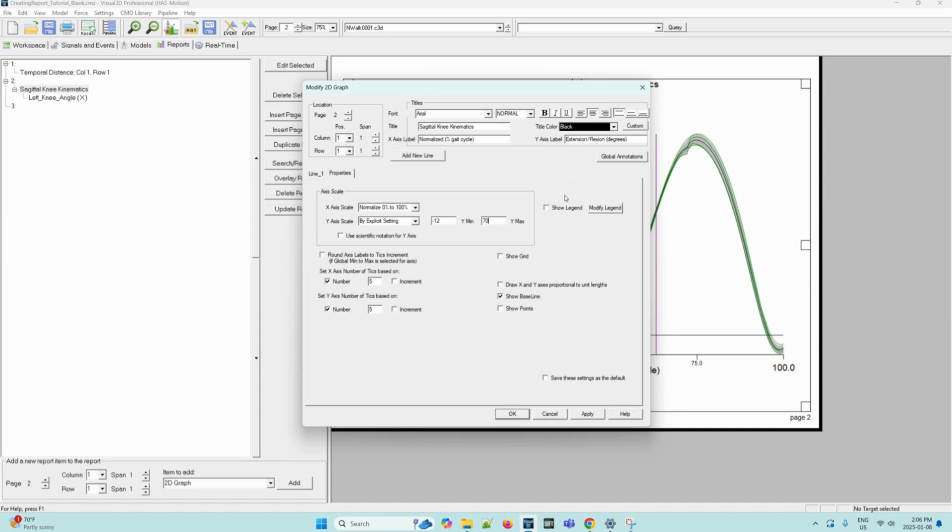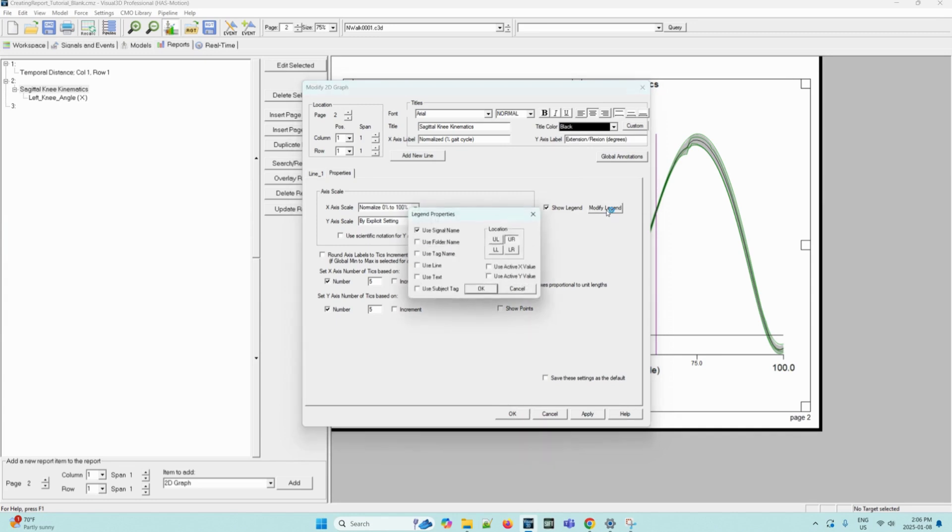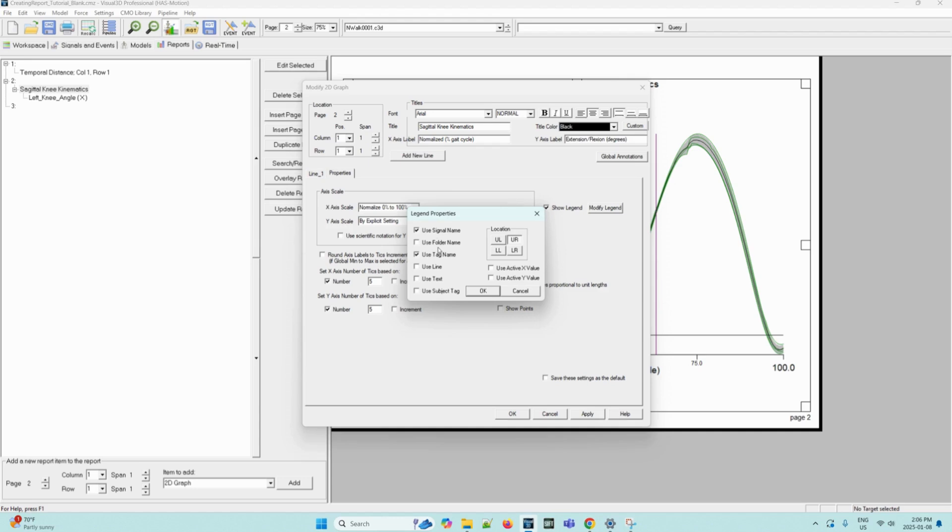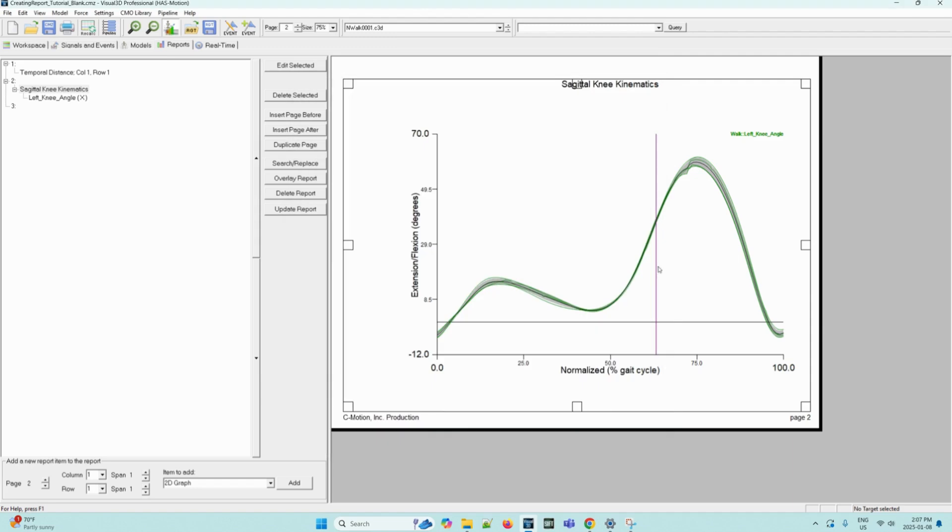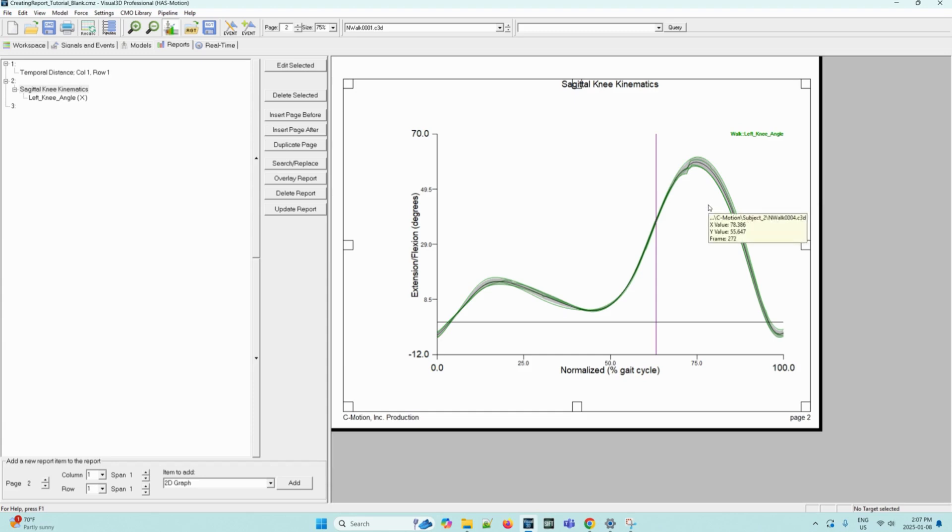Then we can check, click the show legend box and also select the modify legend button. In the legend properties dialog box, check use tag name and set location to UR and then select OK. Now we can select apply on the graph format dialog box. Now if we were to press OK and view the 2D graph, it should now display the tag name walk on the upper right hand corner as we can see. And the minimum and maximum values of the Y axis should be set from negative 12 to 70, which can be seen here.